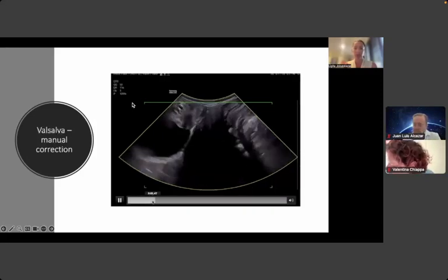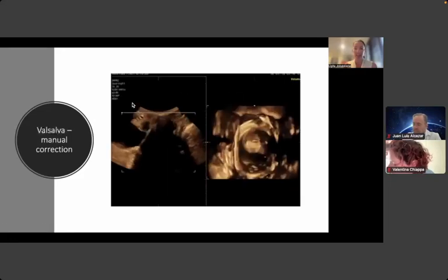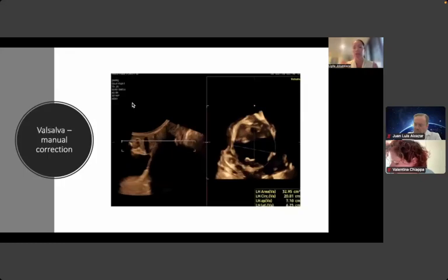Another patient performing Valsalva, and she's pushing and a bit contracting at the same time. And we see here the line is very high and very incorrect. Pelvic assist directly aligns. And also after that, we ask for measurements, and it will measure the hiatal area. And if you see that this line you don't like, it's probably not correct for your eyes, you can again adjust it manually, which probably does not change that much the result. But here we see that the area is 33 square centimeters.